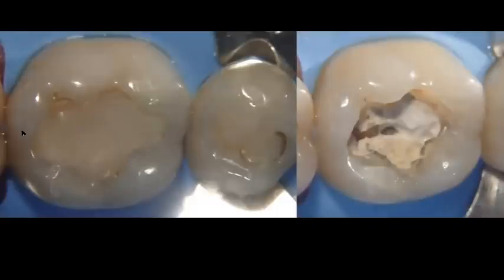We're going to remove the previously placed composite restoration. You can see this is a horizontal technique, and this is a very common technique. But I want you to look at the anatomy. There is no shape. This doesn't look like a tooth. This is just a flat surface, a flat layer of composite placed on that occlusal surface, and at this point you can see the amount of wear that the restoration has.